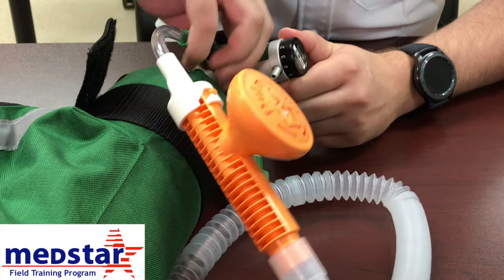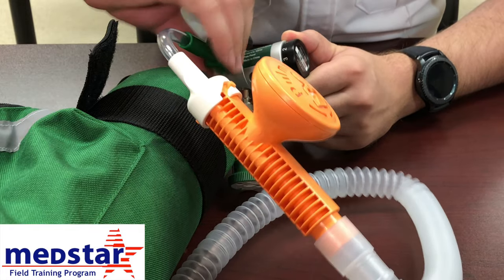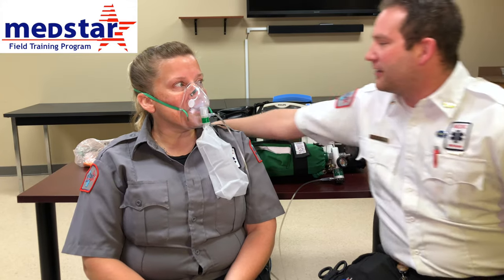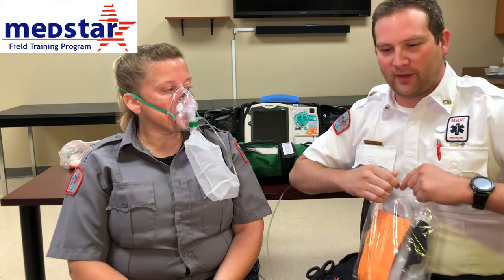To take it off, all you have to do is unscrew it. Now we'll show how to apply the CPAP to an actual patient. If you have a respiratory distress patient already on oxygen, they still meet the criteria and are indicated for CPAP. She looks to be about a medium size, so we're going to pull out the medium CPAP and go ahead and place it on the patient.